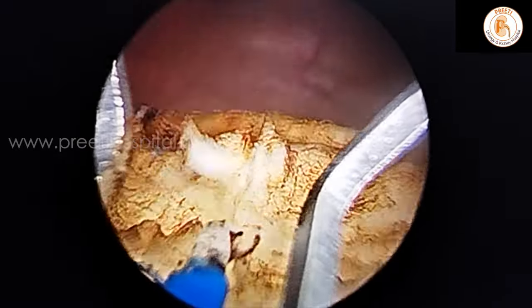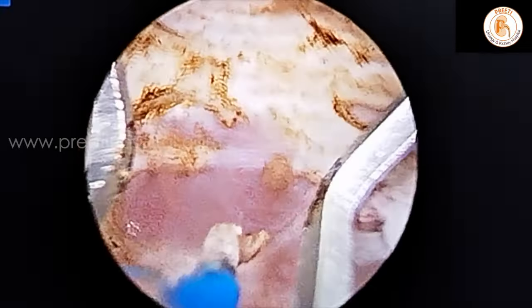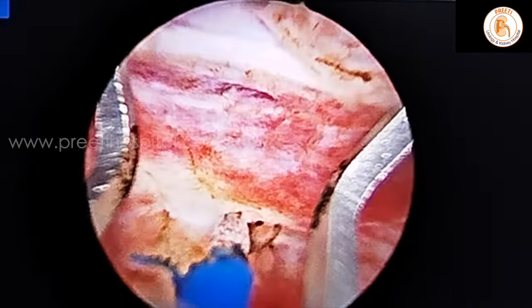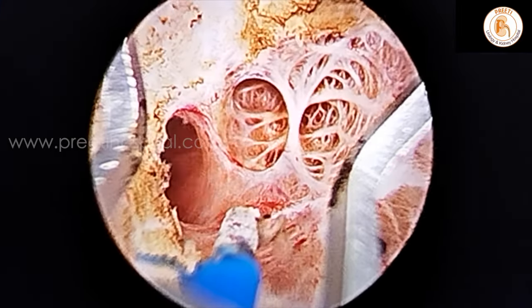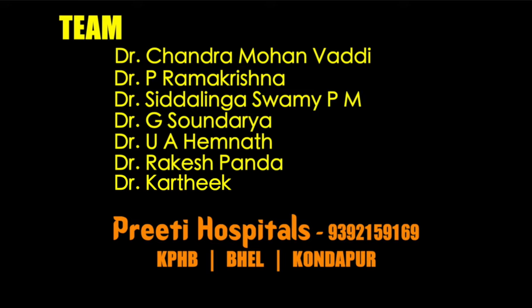At the bladder neck, there is a little gland left. This is the perfect plane — one layer deeper to the capsule. On this side also, one layer deeper to the capsule. And this is total perforation of the capsule. This is the perfect plane. Okay, thank you.